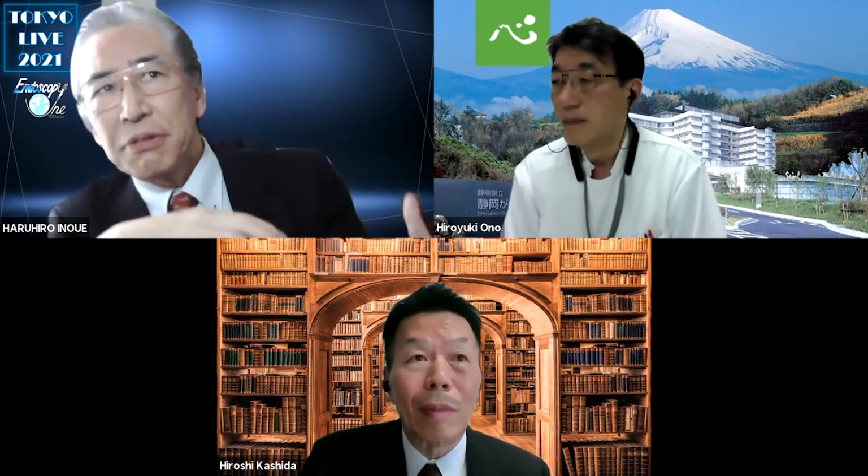Thank you so much. Kashida-sensei, may I ask him one more? Yes, of course. Go ahead. One more question is that this patient received radiation as well, 45 gray radiation. So is there any difference between a case without radiation and a radiated case like this? Any difference when you approach a deeper layer?